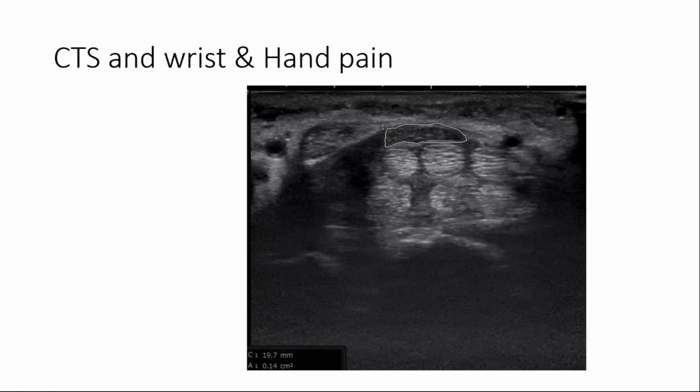Okay, it's carpal tunnel, and of course I did EMG on this one. So should you just end your exam there, or should you spend a little bit more time and find out if there is anything other than median nerve involvement here? The answer is you should, especially in a patient where you have answered one question: the median nerve is hypoechoic, it's swollen, so there is entrapment. You should look for a little bit more and spend a little bit more time.